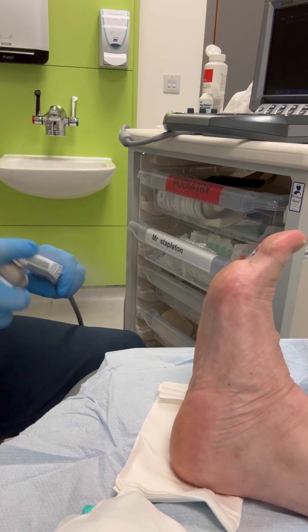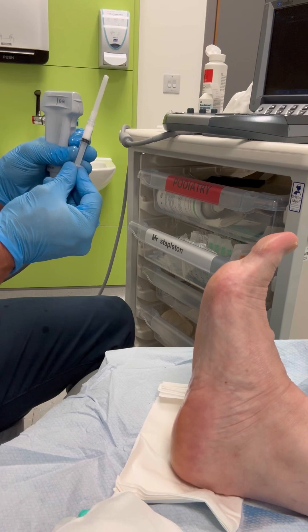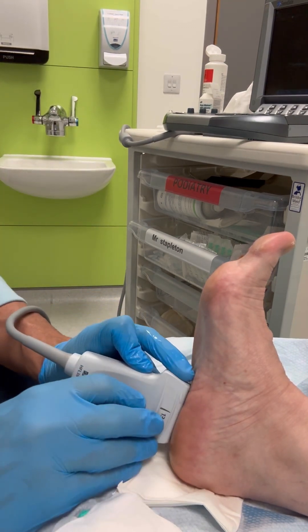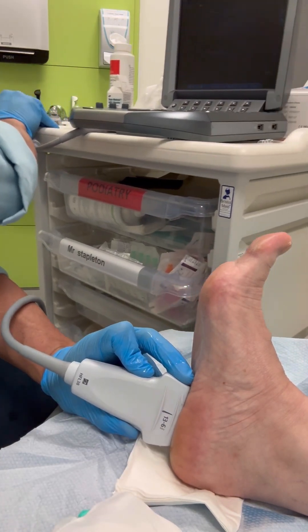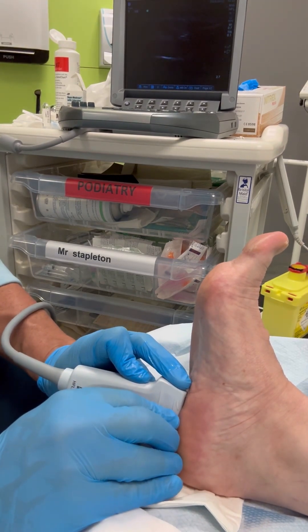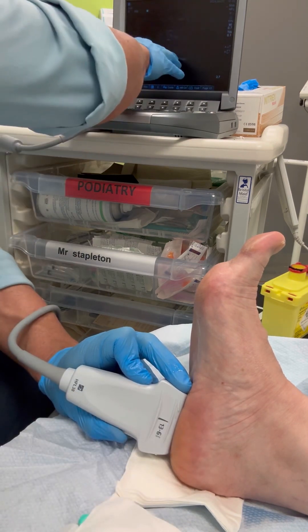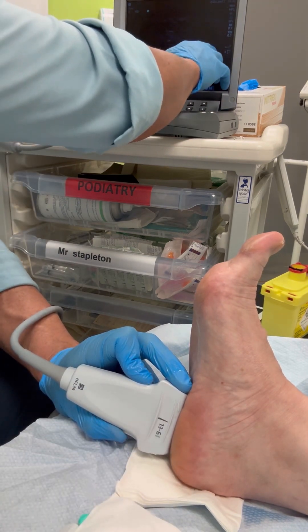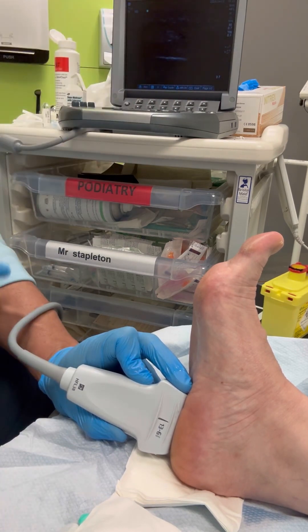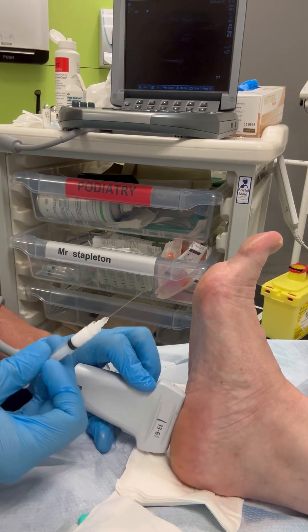I'm performing the injection under ultrasound guidance. We're aiming for the area of most pathology, and this is usually visualised on ultrasound as the thickest portion of the tendon. Utilising colour doppler signal will also highlight areas of inflammation. Having said that, the majority of plantar fasciopathies show little to no inflammatory colour doppler signal, as the plantar fascia struggles to maintain a high level of inflammation with its poor blood supply.